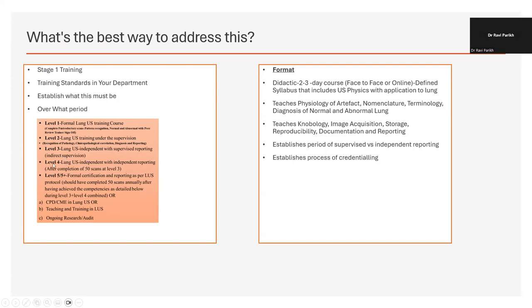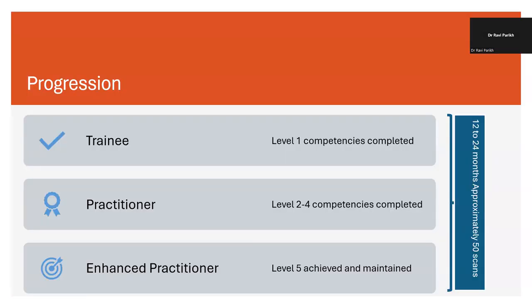But you will then have to practice scanning in your unit. And if you do that without a proper format that establishes that you are reporting consistently, that you are marking your images and using a standard, that would not be appropriate. So if you haven't written your guidelines yet, I've given you one that you can use. But the important thing is that from here, you'd go on to progression, probably doing 50 scans by the time you've finished writing the guideline on your unit.